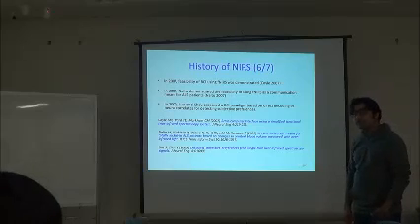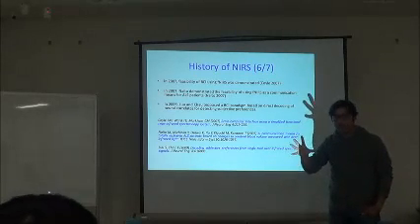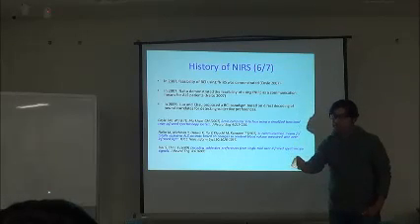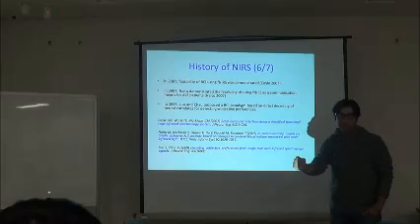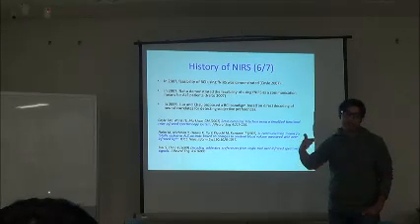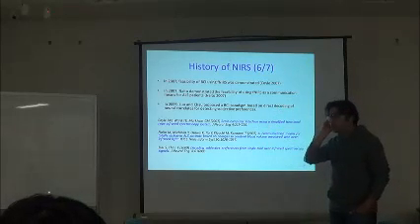They demonstrated it for two tasks, in fact for one task, a ball clenching task. There was a ball, the subjects were required to clench the ball, and the other activity was the rest period. So they classified the two activities and translated them into control commands. They showed that it is possible to do that.